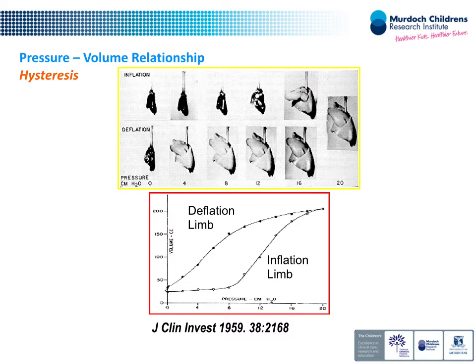Because it is de-recruited, it has low compliance. It's going to take a lot of pressure to initiate a volume change. Then suddenly you get to this point where the slope changes and the lung starts to recruit, or change volume, very quickly. This is the lower inflection point of the lung, isn't it? And then you'll continue to recruit the lung. You'll get to a point where suddenly you get very little volume change for your pressure change. Now you're overdistending this lung.